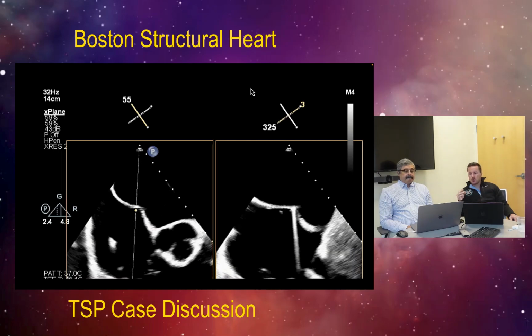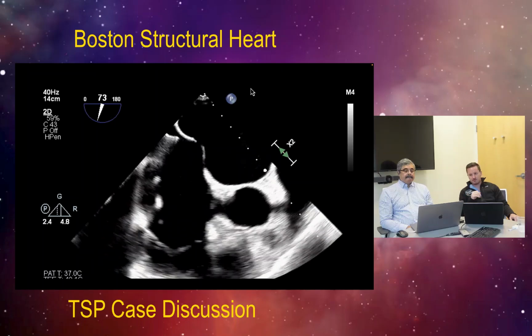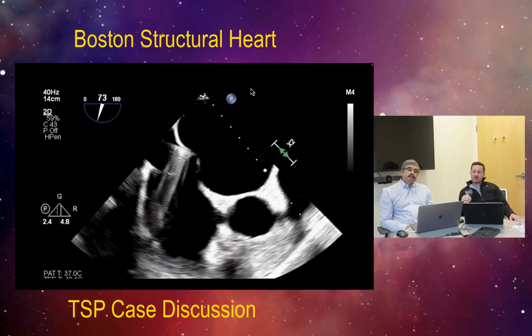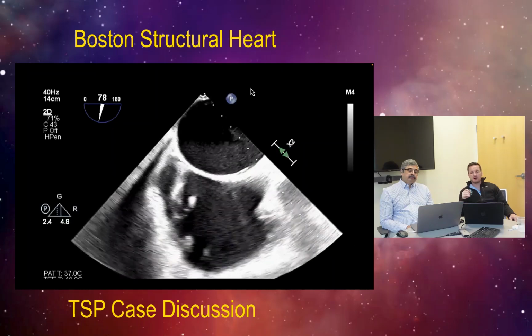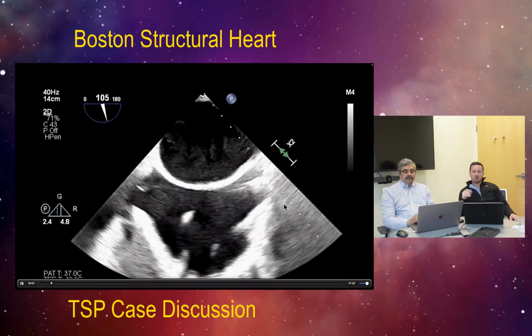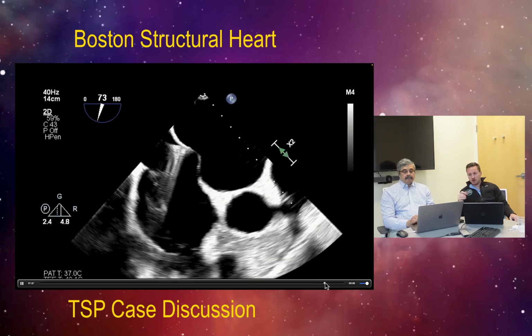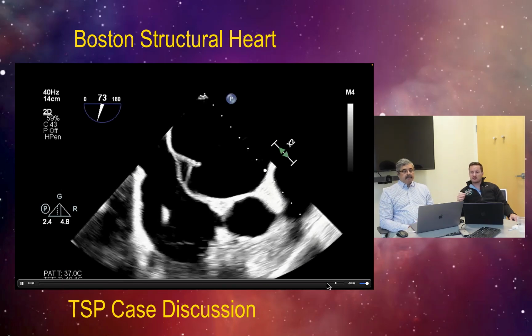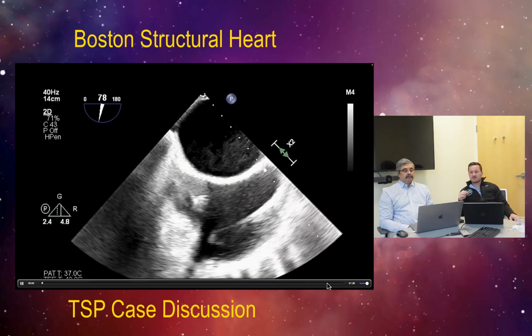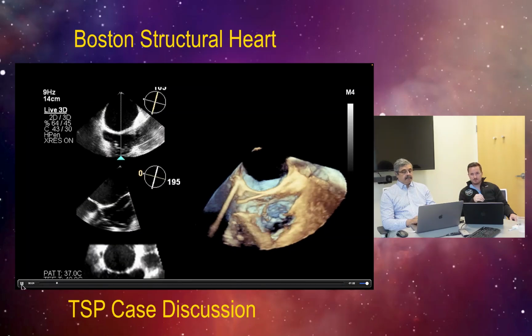and again in this view we're able to see the tip of the needle in both the short axis and the bicaval view. We're now on to the optimization phase, where we're seeing tenting of the fossa ovalis, and we are identifying the exact location where we want to do our septal puncture. And then under continuous guidance, we will perform our septal crossing under continuous TE guidance.